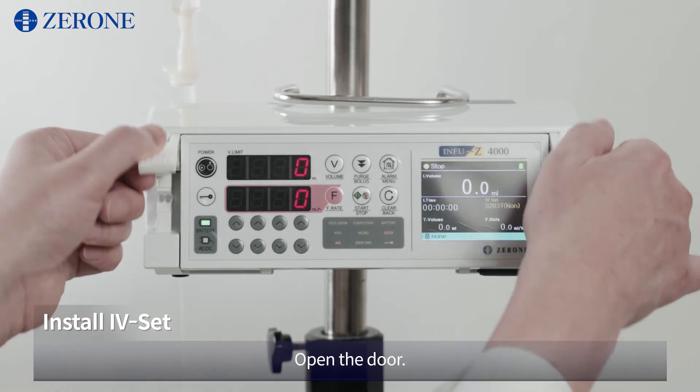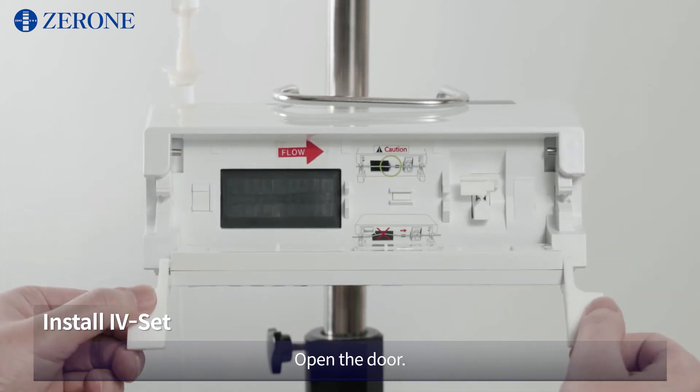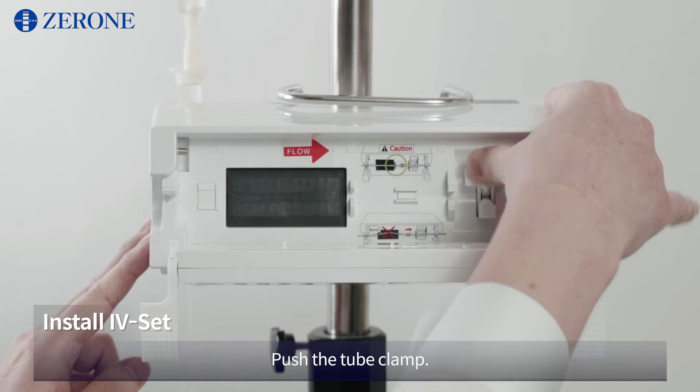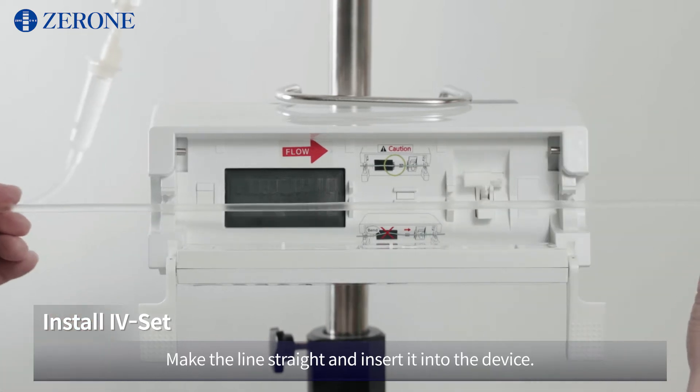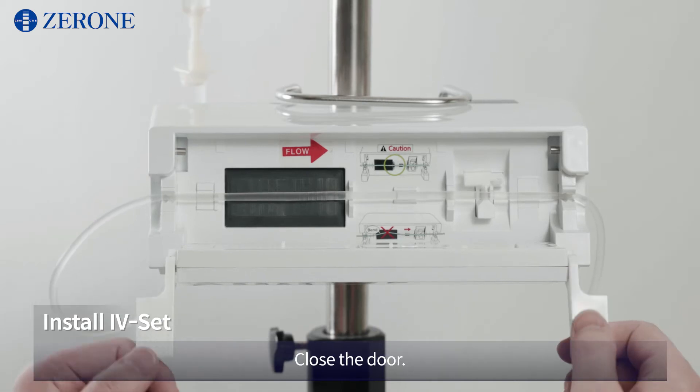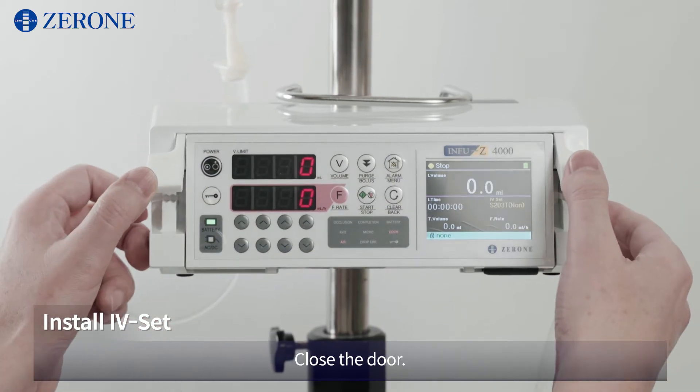Open the door. Push the tube clamp. Make the line straight and insert it into the device. Close the door.